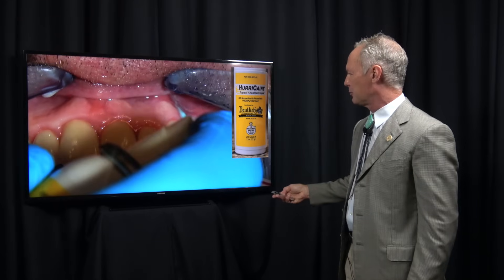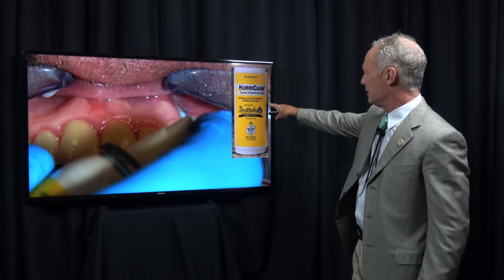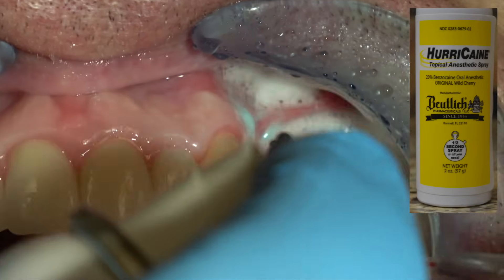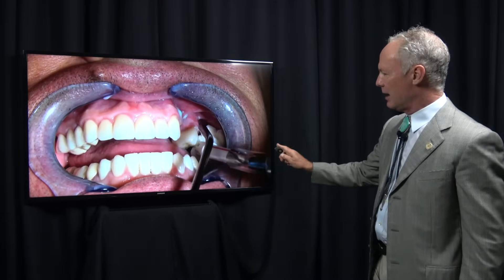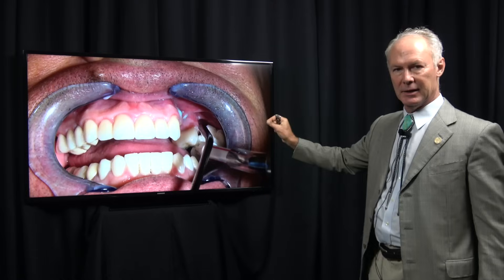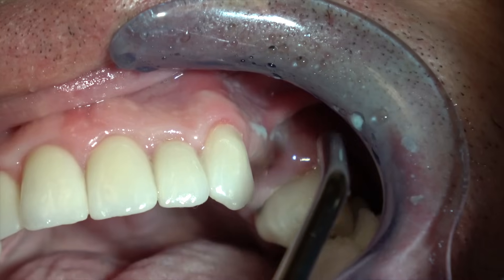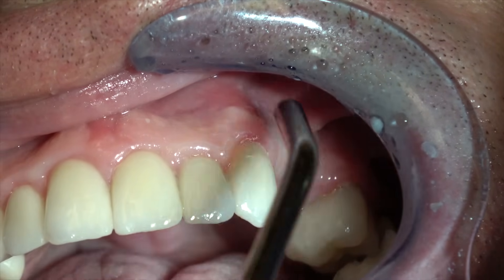Then spray the tissue with Hurricane topical anesthetic spray — this is 20% benzocaine. Again, there's a 2x2 in the back of the mouth. I'm blowing this in with my air syringe, blowing it into the tissue. This is an incredible local anesthetic method. Your patients will love you because they won't feel a thing.